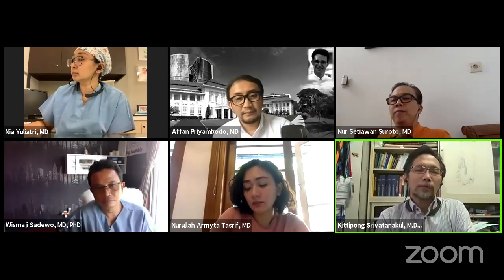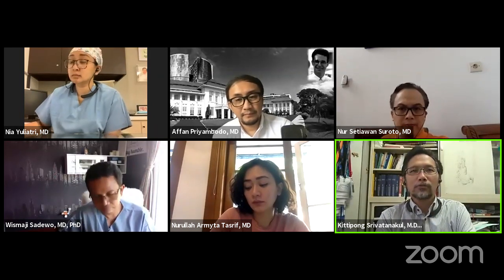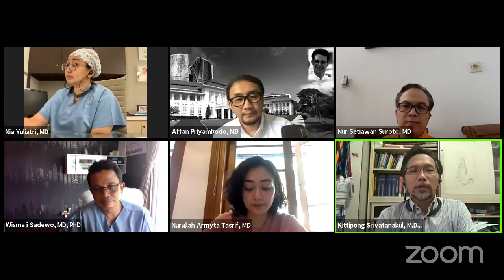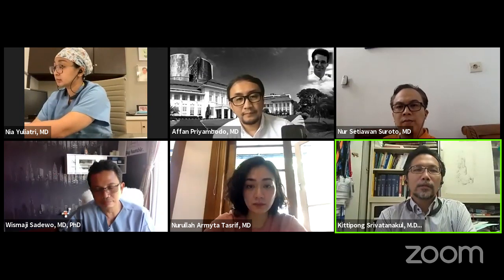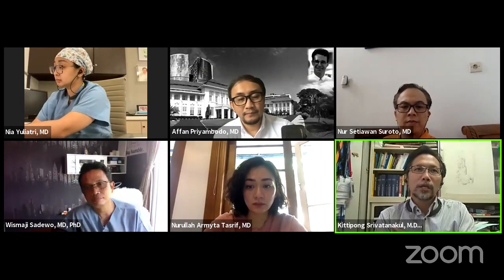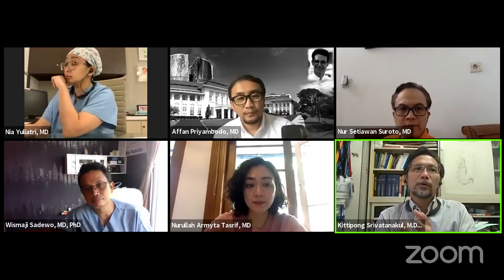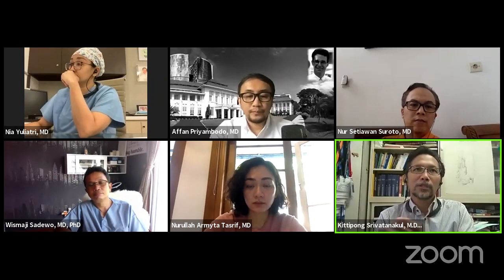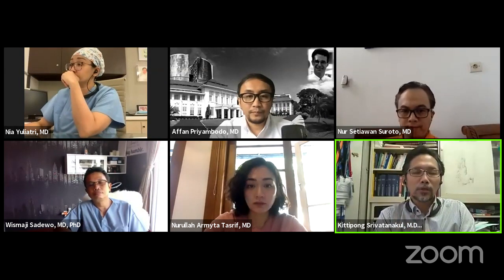But if you use particles and you damage part of the supply of the facial nerve, you will have only temporary facial palsy. So that's how to take care of cranial nerve palsy. Use larger, less penetrating material. That's probably very true when you want more safety with the cranial nerves.